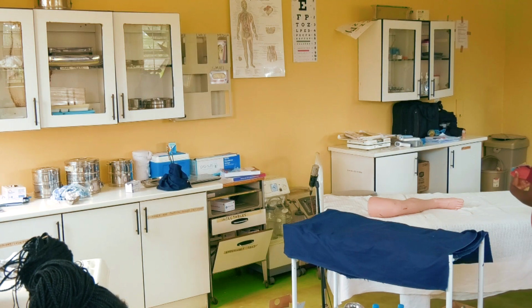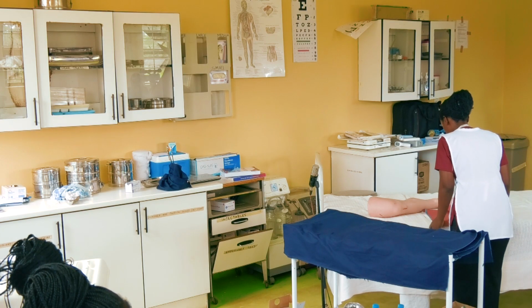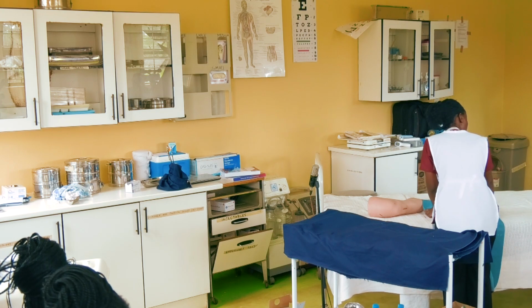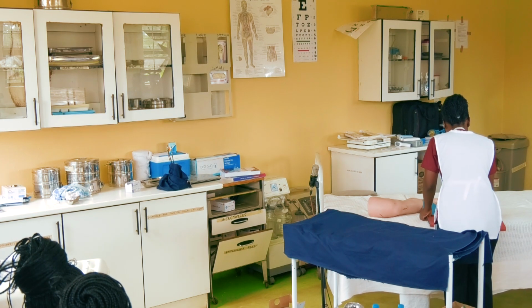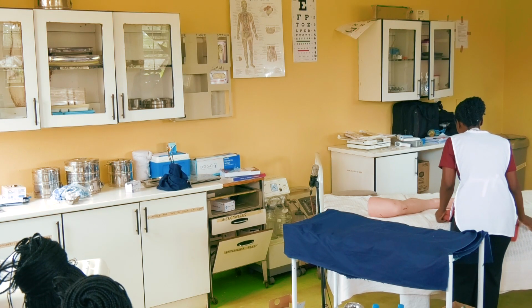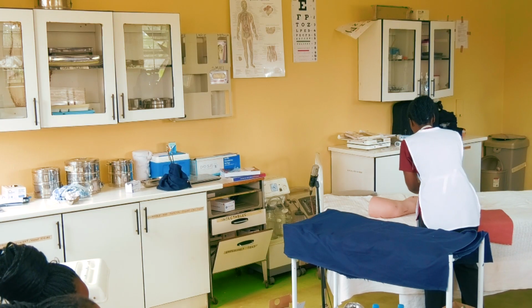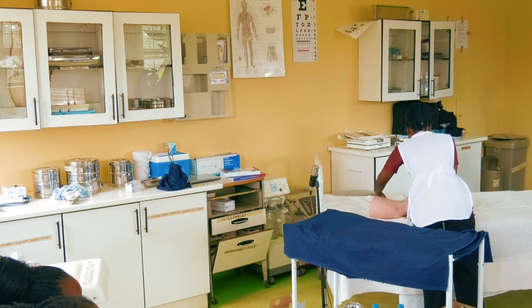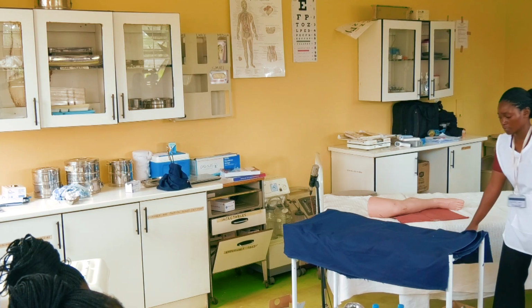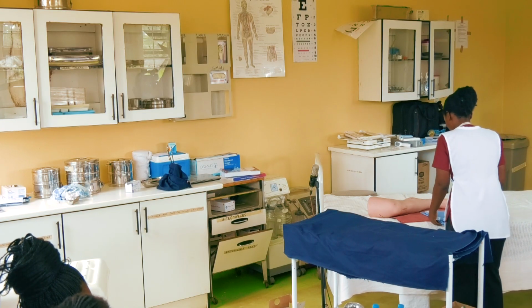Which one goes down first? Just like that. Fold it, it's fine, the way it was folded, since the area is smaller. So you ask the patient, I want to place this under your leg, lift, then push it under. She's supposed to be gloved, right? Yes. Yeah, so the wound was assessed and everything else. Put the other one. So it should be folded as well.